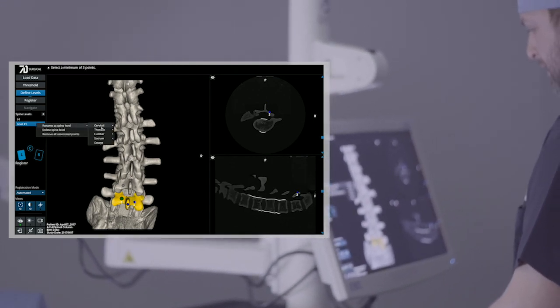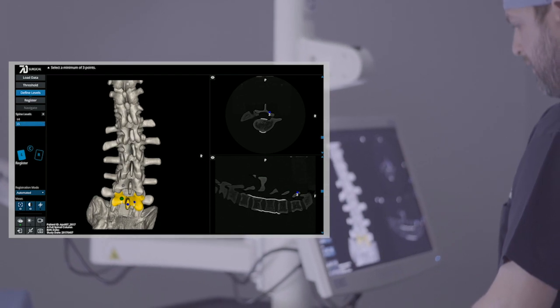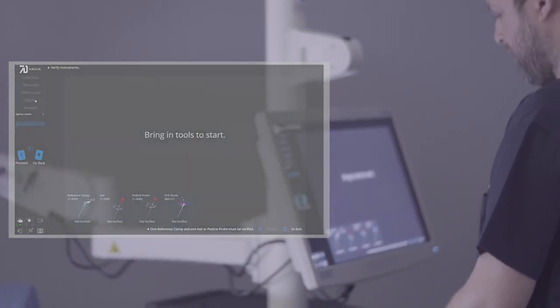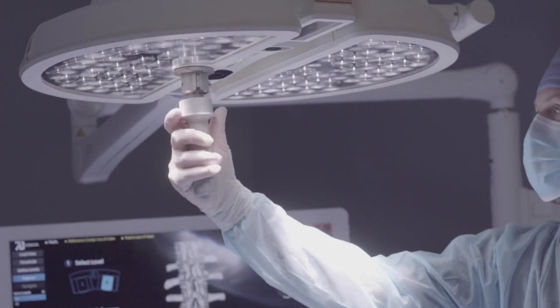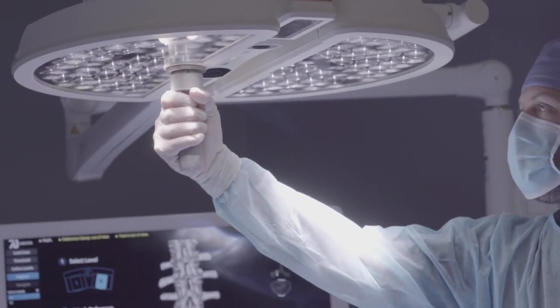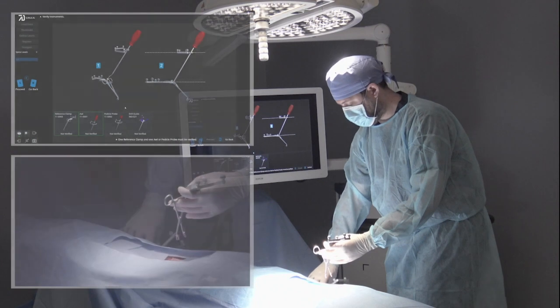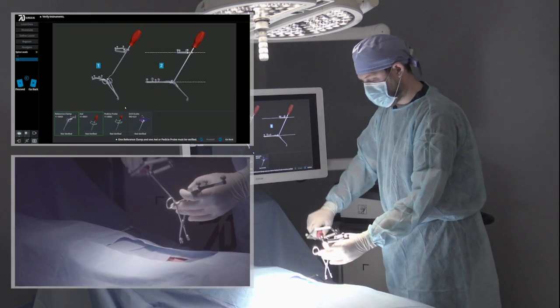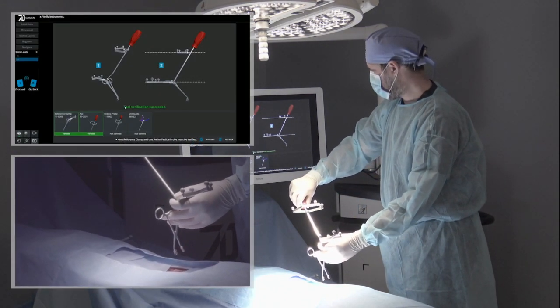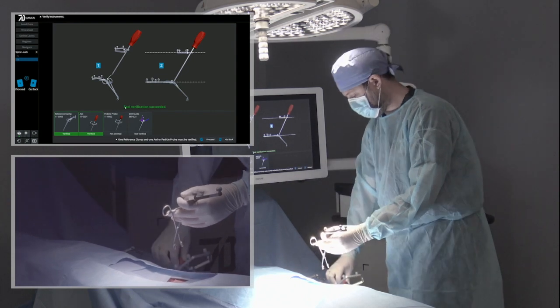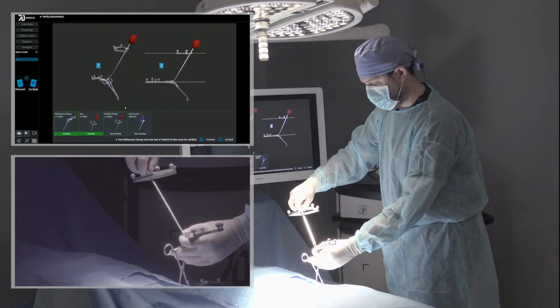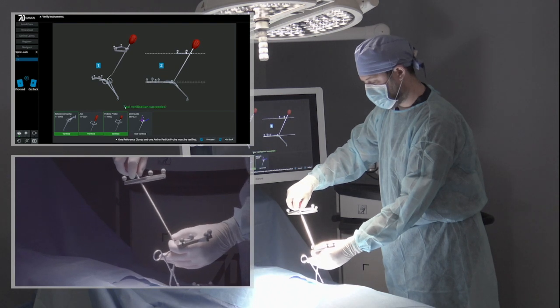Next, we begin the registration process with the sterile workflow. First, the sterile light handle is placed on the system head. Next, the tip of each tool is placed into the divot on the reference clamp and shown to the cameras. This process will verify that the navigated tools are still accurate after sterile processing. Tool verification is only necessary once per case.